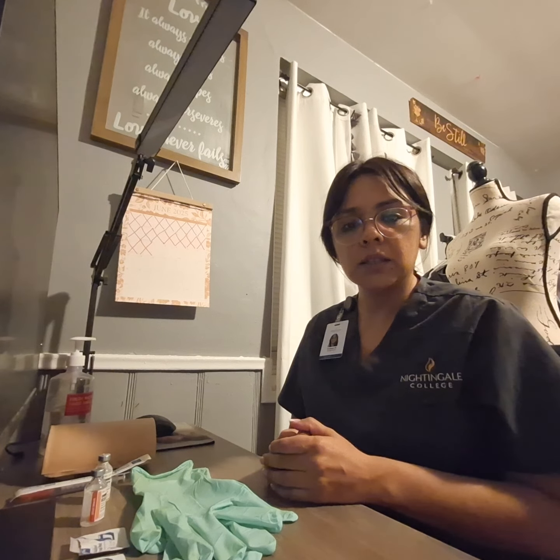Hello, my name is Stephanie, and today I will be performing the drawing up insulin skills video. I'll start by verifying the doctor's orders.